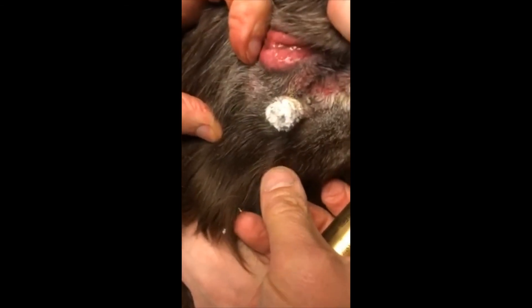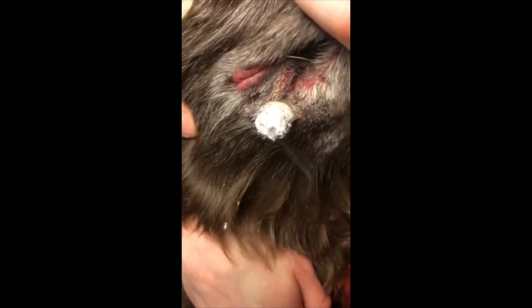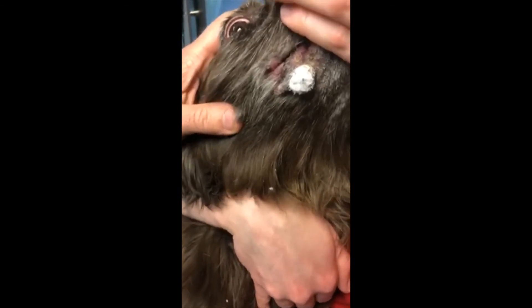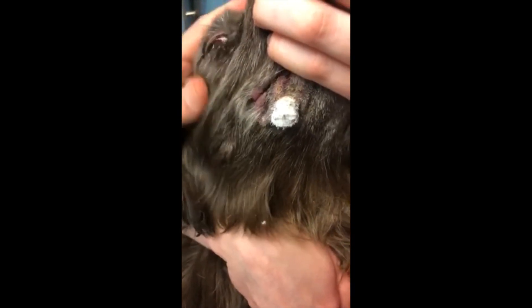That's what the mass looks like post-freeze. It will probably take approximately three weeks for this tissue to completely necrose and scab over, at which point we typically recheck them. In some cases with a large mass like this one, we will need to do a repeat treatment.